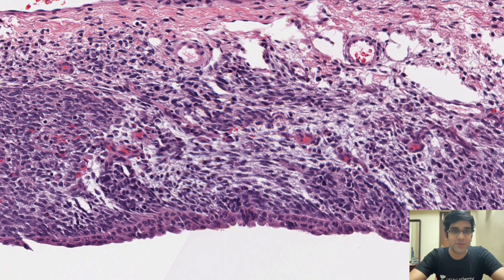So here, what I'm seeing is the stroma. Obviously there are some empty spaces, and I'm not going to comment on the empty space. I do have a vessel here. I cannot see the alveoli per se, right? What you can see is lots of cells here which are kind of spindled, and in some places they are round blue cells, right? I'm not exactly sure of what it is, so let's go through it.